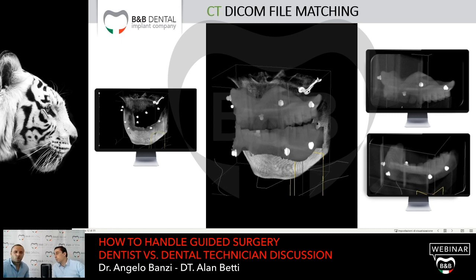Check also the resin liquid part that you are going to use to rebase your prosthesis, to see if there is metal, because metal in the mouth of the patient can cause a scattering effect.